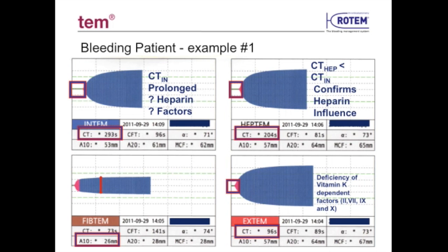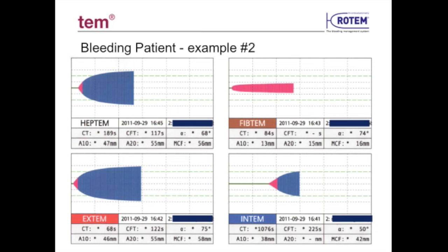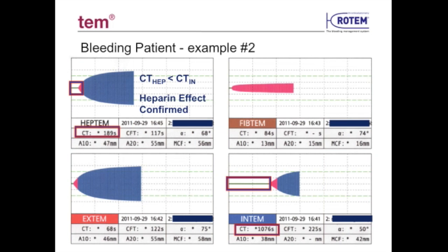Looking at the A10 value of FibTem, there is a very strong fibrin contribution to clot firmness — the A10 is 26 mm, already above the upper end of the normal range. In another post-operative cardiac surgery bleeding example, a significant prolongation of CT in Intem is seen. A corrected CT in Heptem confirms heparin effect, and additional heparin reversal is indicated. The A10 of FibTem demonstrates good amplitude of 13 mm, and A10 parameters in both Heptem and Extem — 47 and 46 mm respectively — also demonstrate overall good clot firmness.